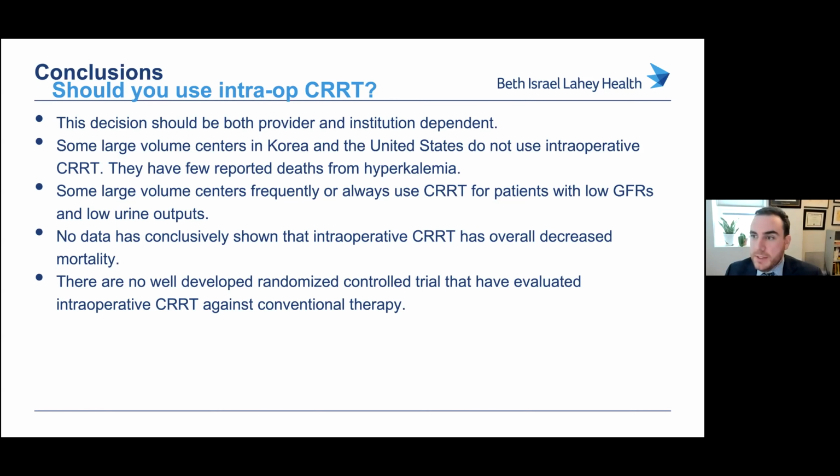I don't think his BMI was 18. You take a few liters off of him, his real BMI might be 15. And our renal replacement therapy, the CVVH machine doesn't have a heating element on it. And I don't think many institutions have heating elements on it. So if you're going to use CRRT on patients, you have to keep a very close eye on their temperature. And how do we mitigate it? It's very hard to mitigate it.